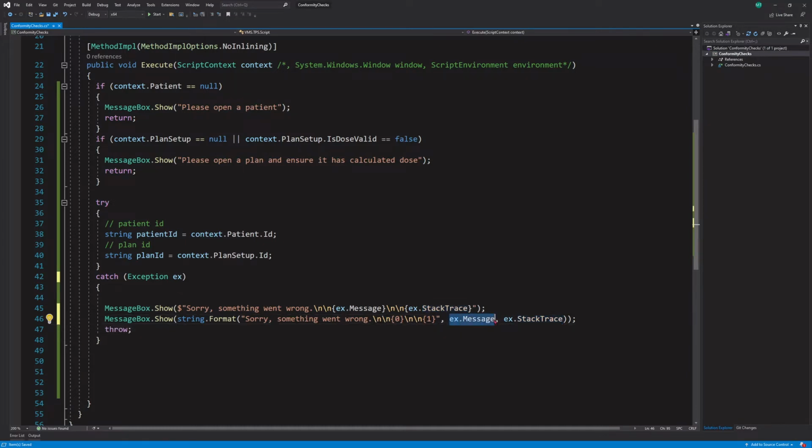So that's this first position. This is the 0th position. This is the first position, but it's actually the second position. Like this is 0, this is 1. So that's 0 index. That's what that means.